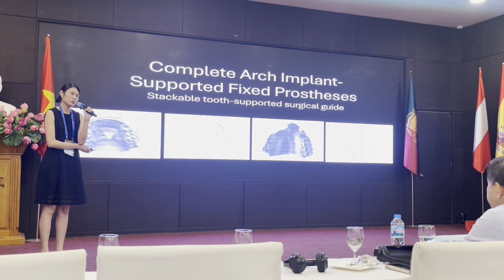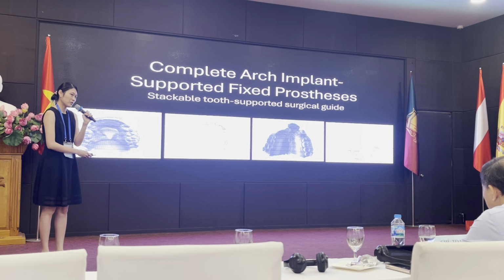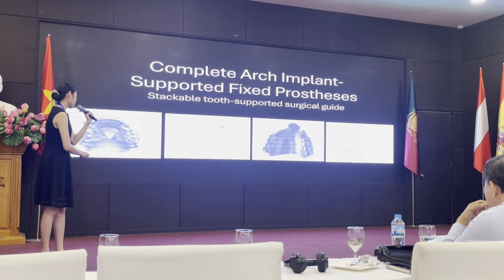And now if you want to do full mouth rehab, what we can do is the stackable tooth-supported surgical guide. And this will involve collecting the patient data. Patient data will be the patient scan, bite registration, and diagnostic wax up.